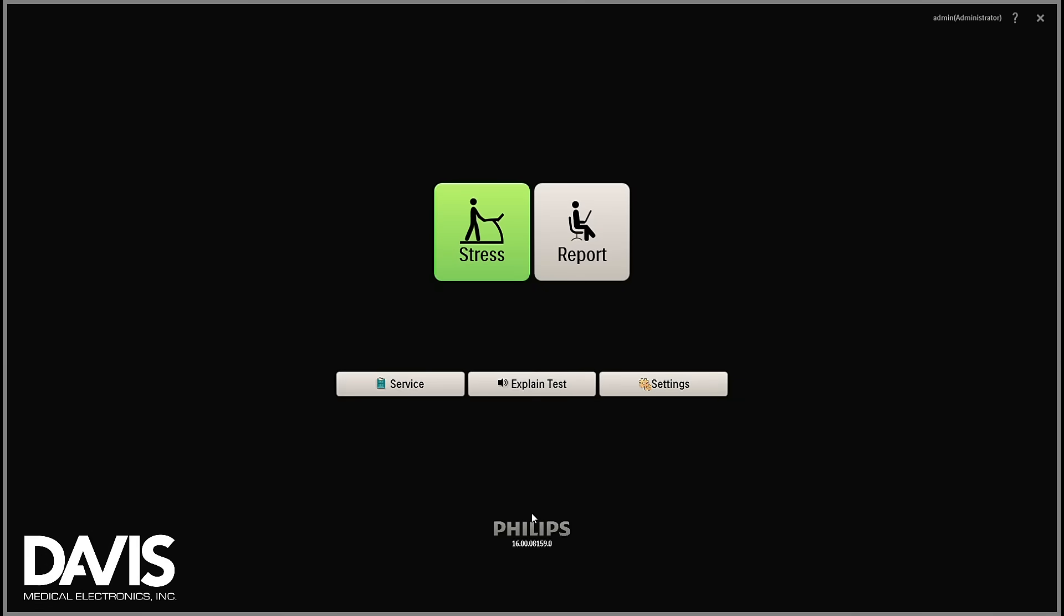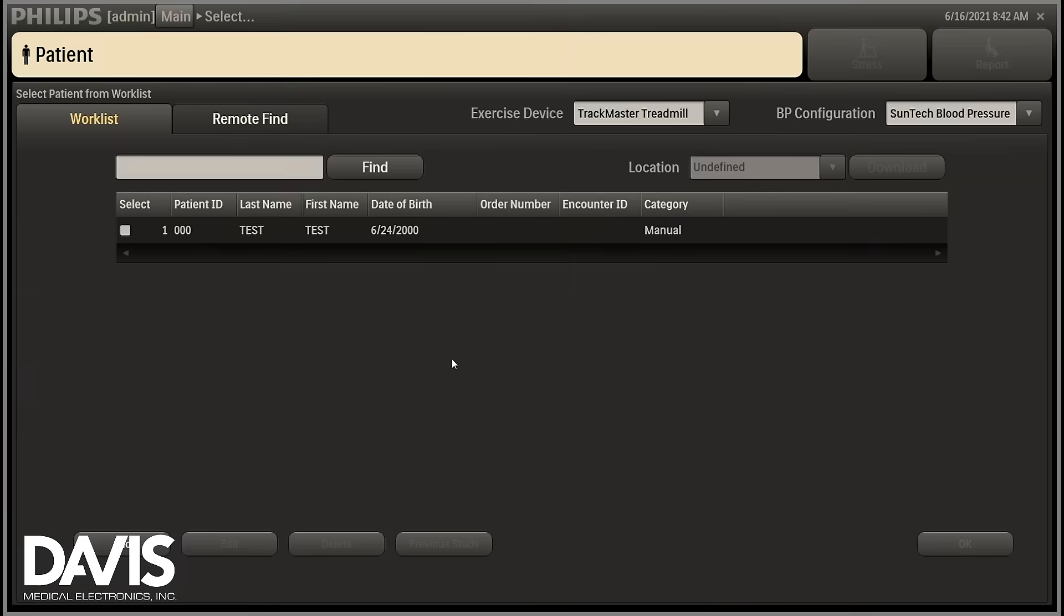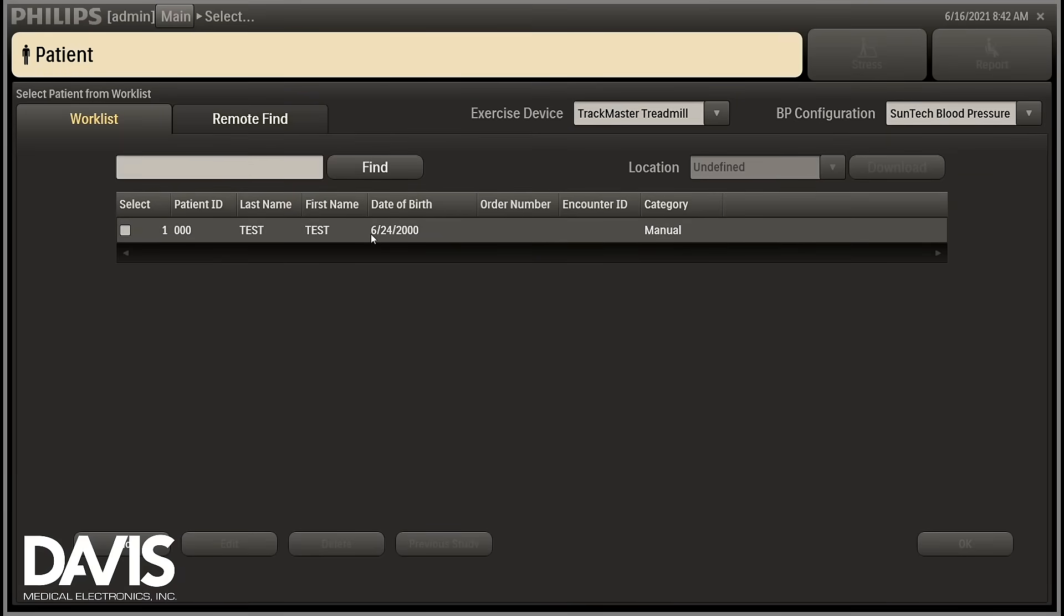To verify that your patient module is communicating, go back into your software, select stress, and select a patient study.